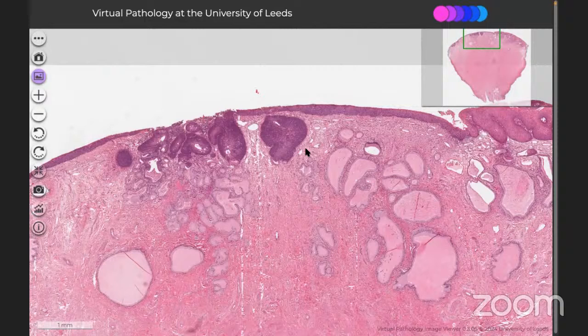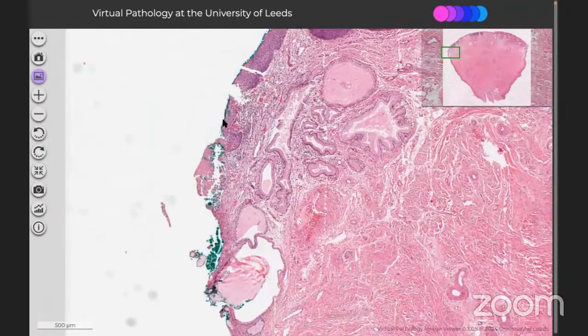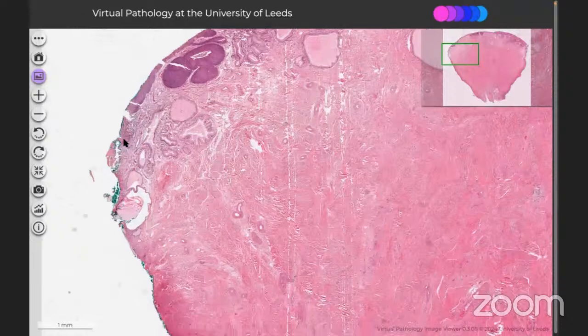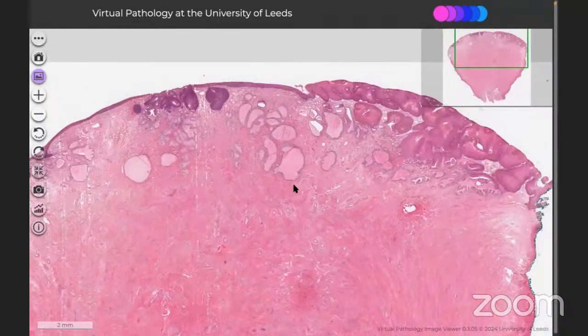Number one, you will correlate with the cervical screening and the HPV serotype. It is expected to be positive or high risk group. And in the morphology, we will corroborate with a P16 IHC. So these are the two important steps you must mention. And you say that HPV is the risk factor for cervical carcinoma, and the lesion is reaching up to the ink margin. So whatever the surgeon has done, you need to discuss it in the gynec MDT, because it is seen at one of the ink margins, and there is actually no invasive carcinoma. So the case can be followed up in the gynec OPD or whatever they decide at the MDT.